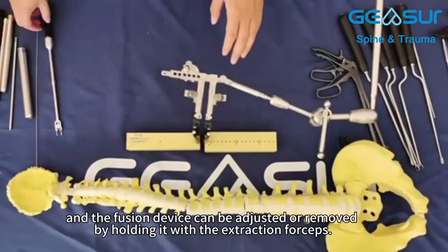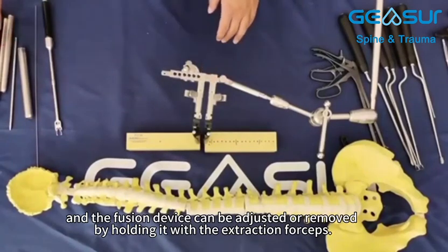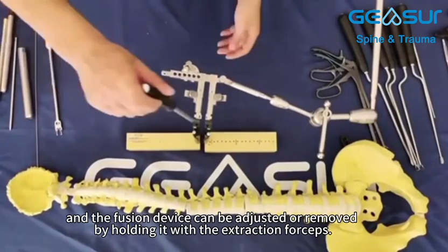The fusion device can be adjusted or removed by holding it with the extraction forceps.